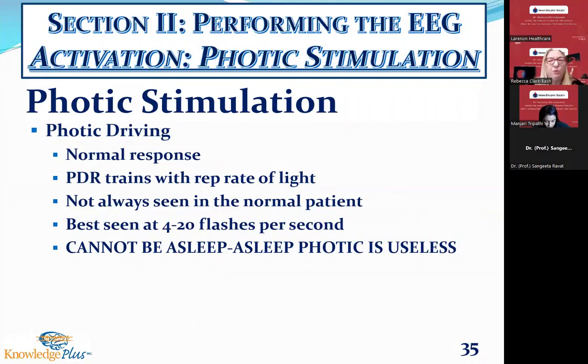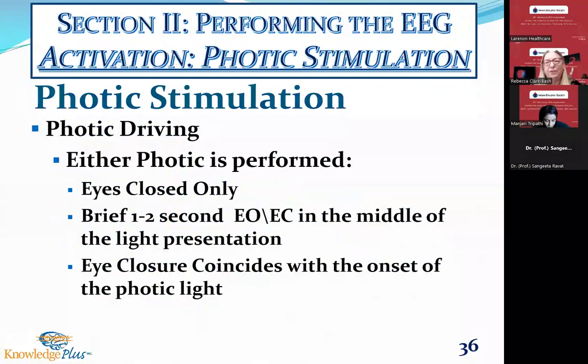If you do photic during sleep, if the patient's kind of drowsy and you're like, open your eyes, close your eyes, you're not going to get any diagnostic yield from that. Now, there are several philosophies on the best way to do photic driving. So either photic is performed the entire test with eyes closed only.